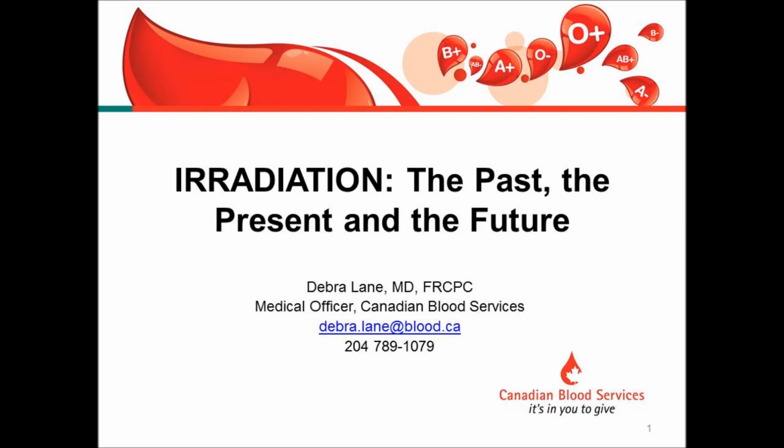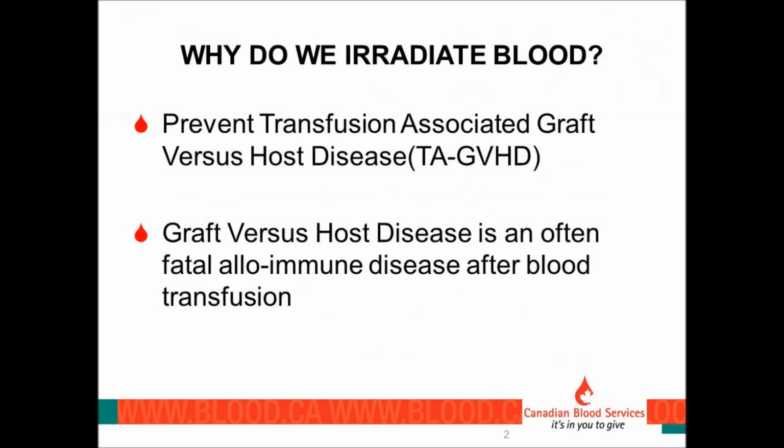Thanks for asking me to speak. So my talk is entitled Irradiation, the Past, the Present, and the Future. I'm covering some history so everybody knows why we irradiate blood, and that's to prevent transfusion-associated graft versus host disease. Graft versus host disease is often a fatal alloimmune disease after blood transfusion.